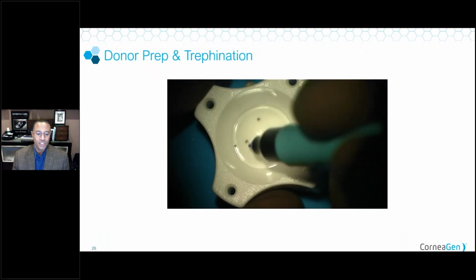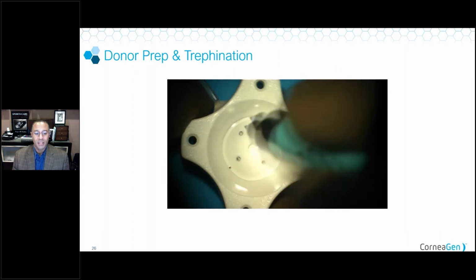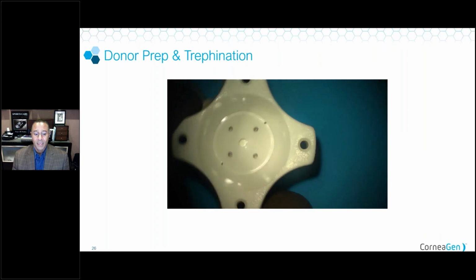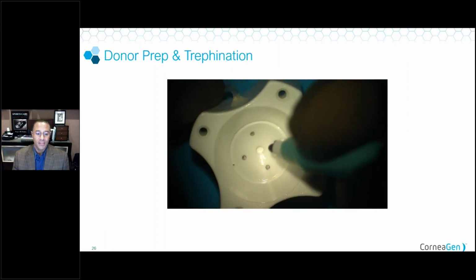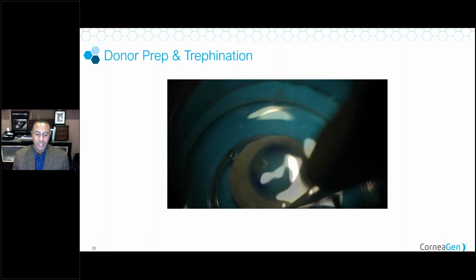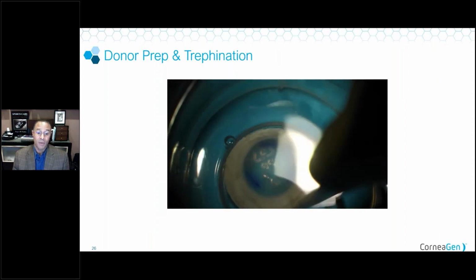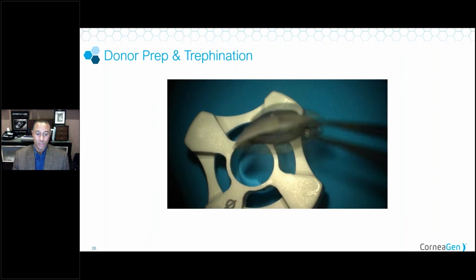Here we've got preparation of the donor, and I'm basically just marking the donor with that trephine. The four holes here are for suction, and then the center hole in the middle. Those will transfer onto our donor cornea, and those will match up perfectly with the recipient trephine and the marks that the recipient trephine will make, so that there's no guessing in matching those two things up.